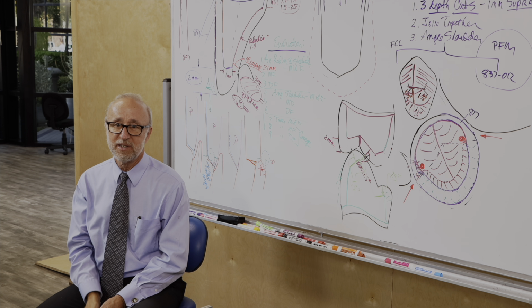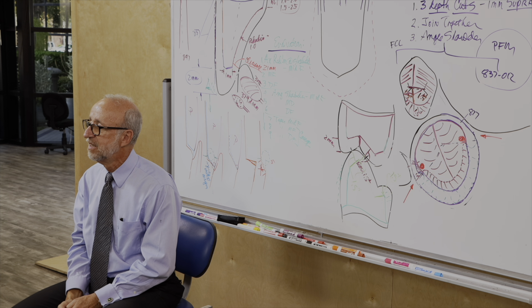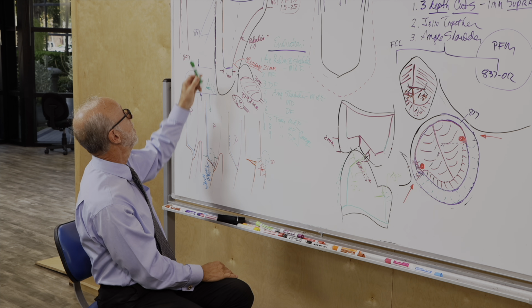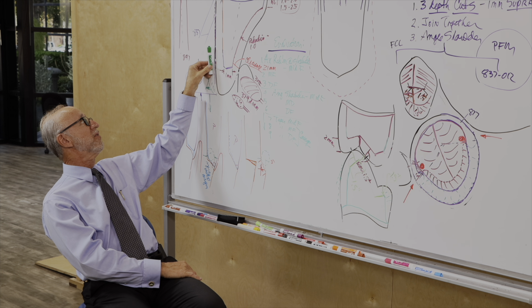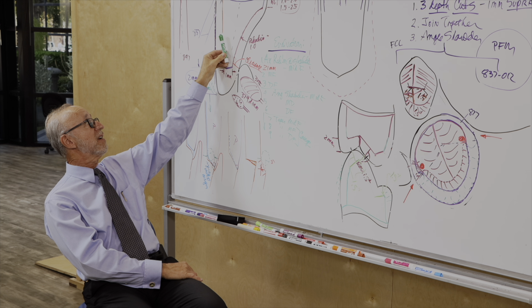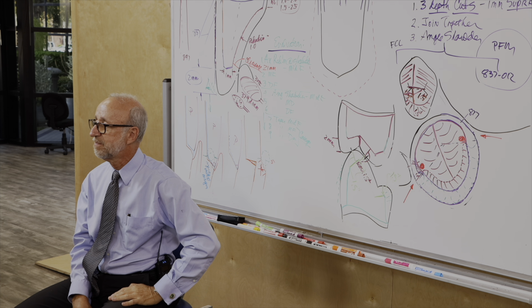That's a good rule of thumb, huh? And it's the same for anterior teeth? Yeah, sure. So what we're doing right here, there's the secondary plane there. Again, put the burr against the adjacent tooth at the level of the incisal third. And if there's something to cut, then we cut it. If you over tapered that already, obviously you got tons of reduction there, so you don't need it.